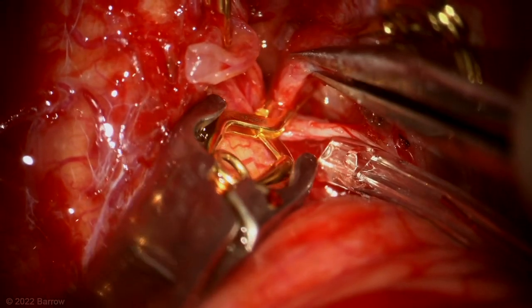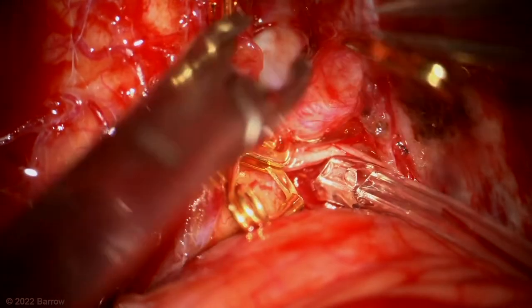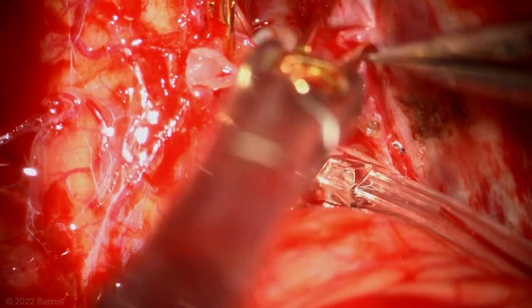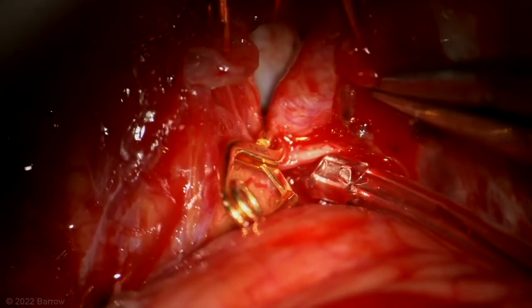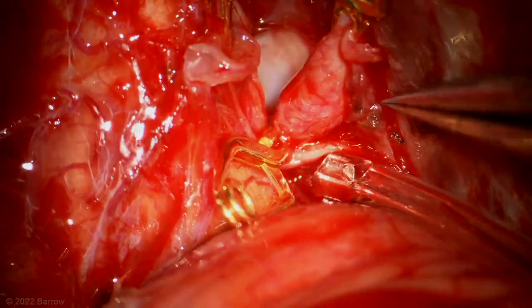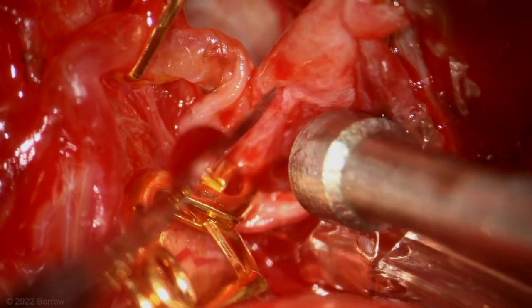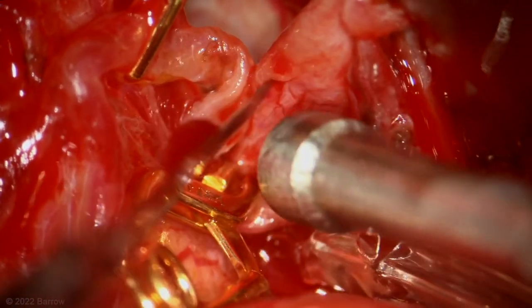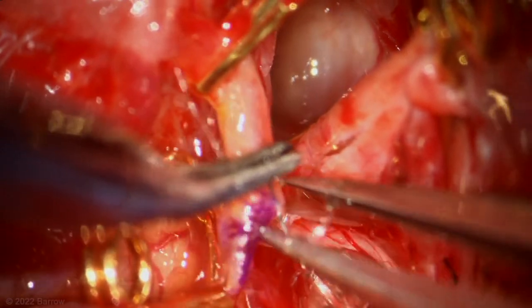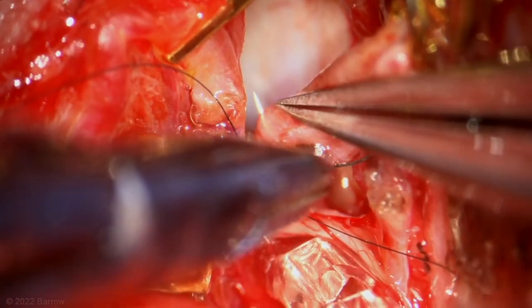Now, the temporary clips are going on the vertebral artery, both distally and proximally, with some readjustment of the proximal clip. This will be our landing zone for the re-implantation. My arteriotomy is made with a number 11 blade. Notice how thick-walled the vertebral artery tissue is — it's important to clearly visualize all layers of that vertebral artery wall.